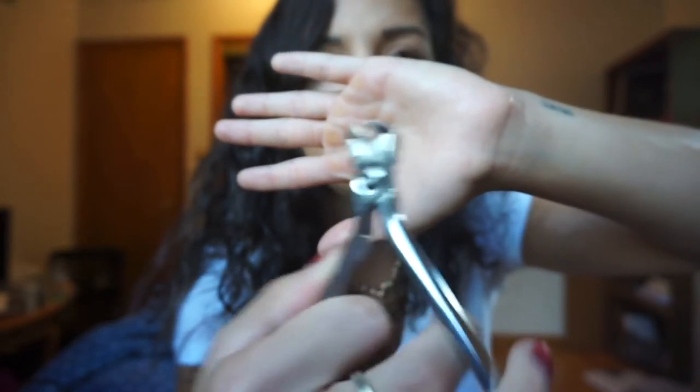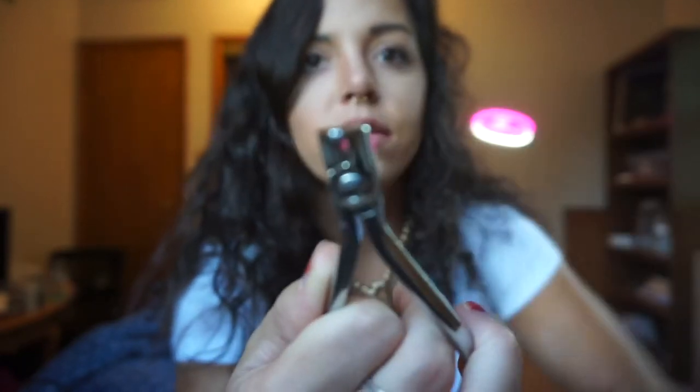This is a distal end cutter. When we put the wire in the arch, sometimes the wire will be poking the patient's cheeks, so this is what we use to cut the wire in the back. It does make a click noise when you cut the wire.